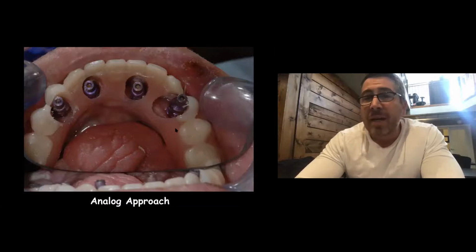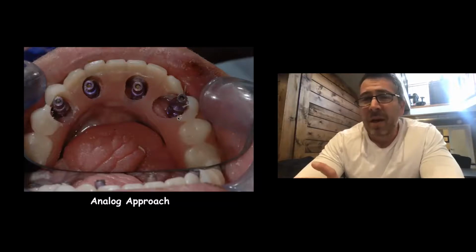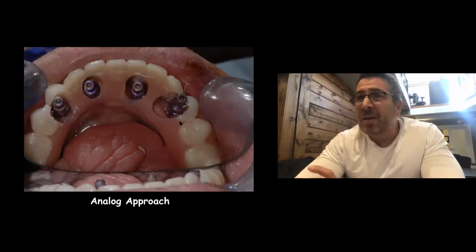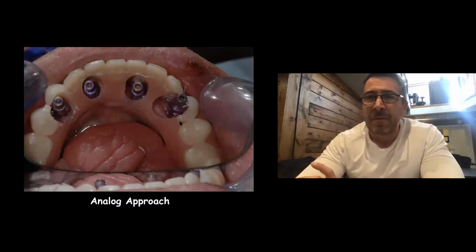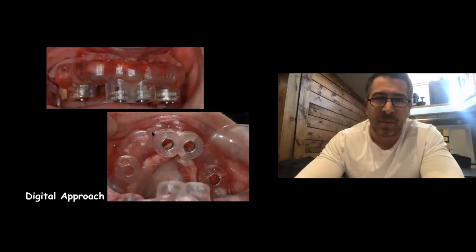Old school, I could use the denture setup and I could flap the patient and I could place the implants using the denture as my guide in combination with my understanding of the bone to see where the implants belong. So that would be my old way of doing it. And actually, it's the way I do the majority of them, quite frankly.